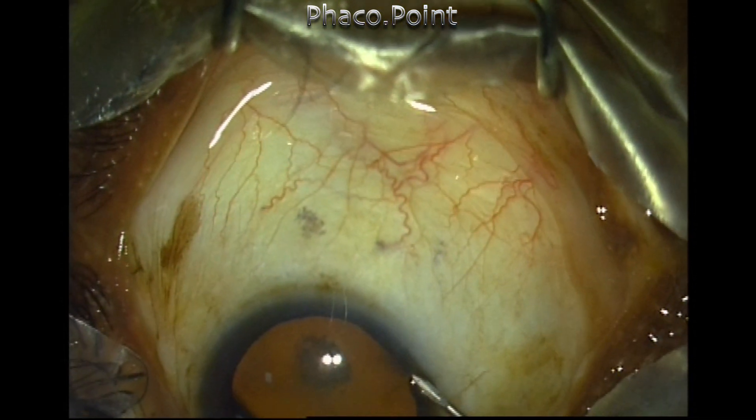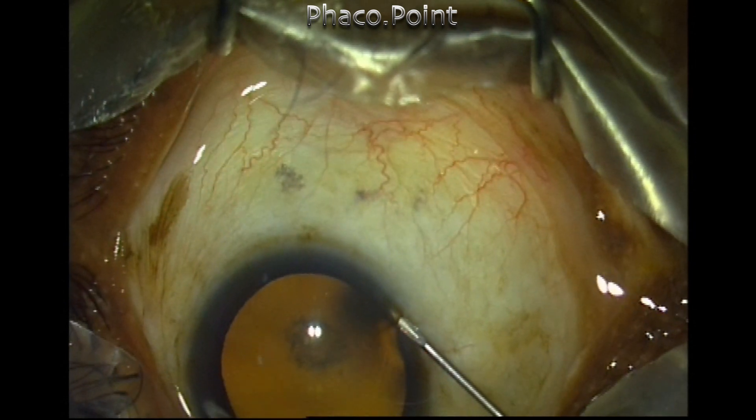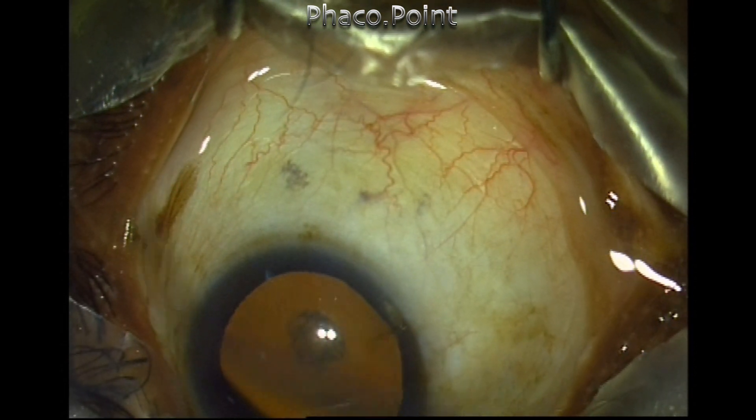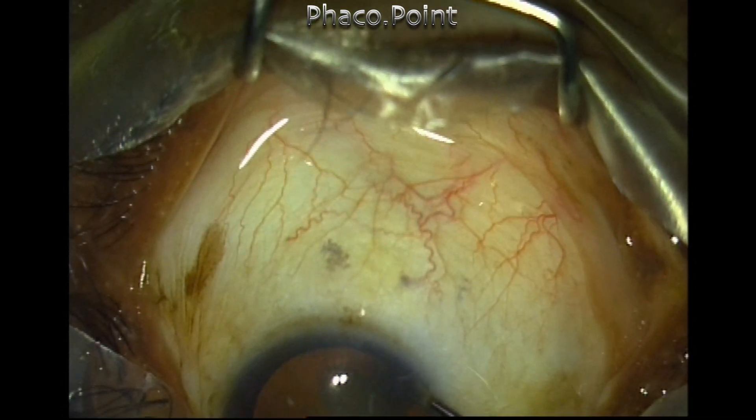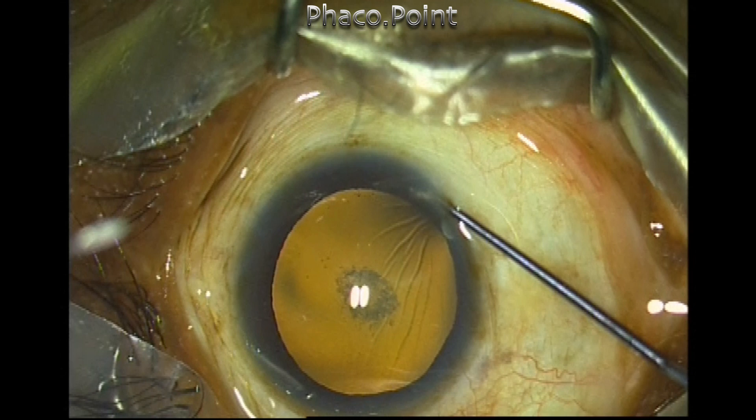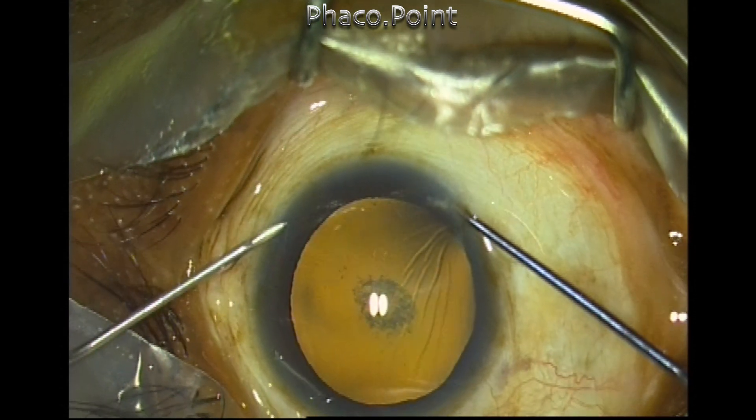I create the small corneal pocket with the help of a 26 gauge needle — about half the bevel length is all that is needed. Using the rod, you can get a firm tangential hold and you can move and steer the eyeball into the straight-ahead position.